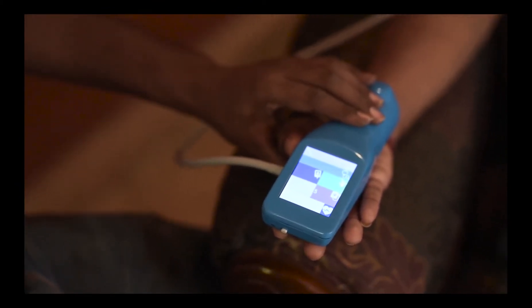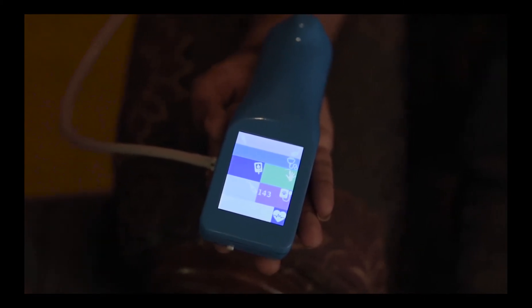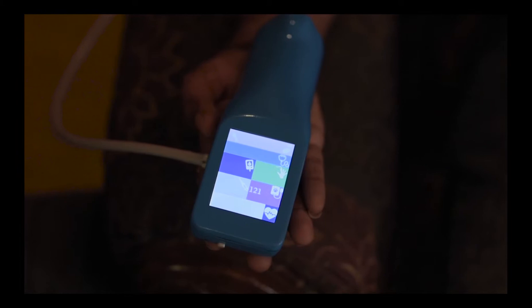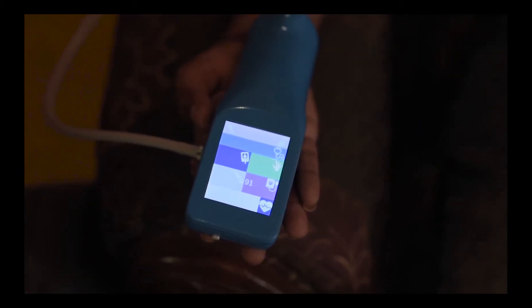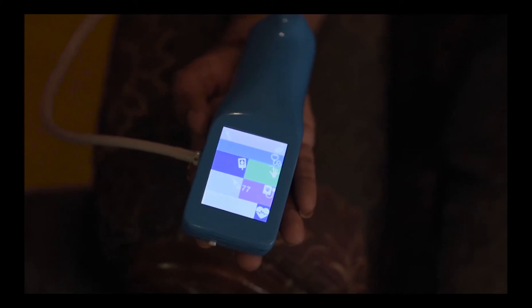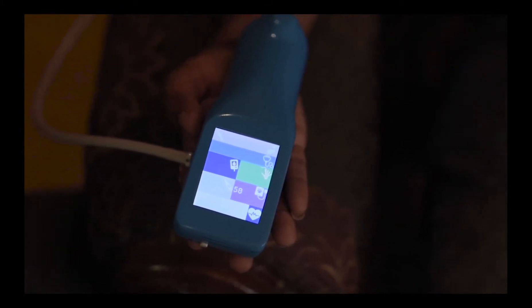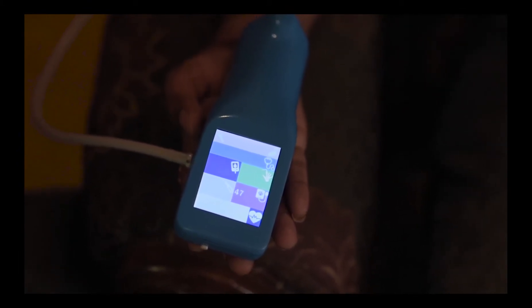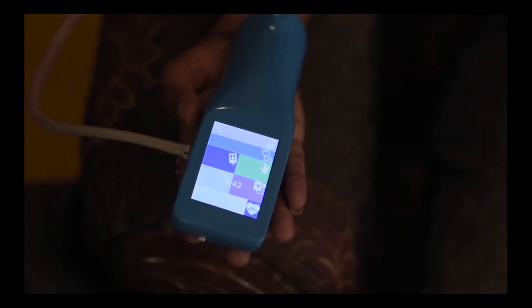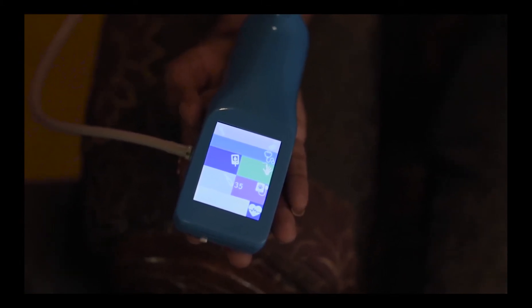Please notice that there are no bends on the tube. Once ready, we activate the blood pressure measurement by touching the screen. The inflation and deflation happens automatically. The blood pressure of the patient is then captured on the screen.